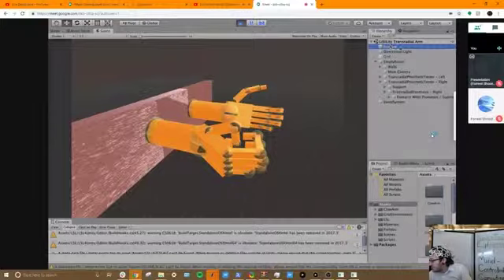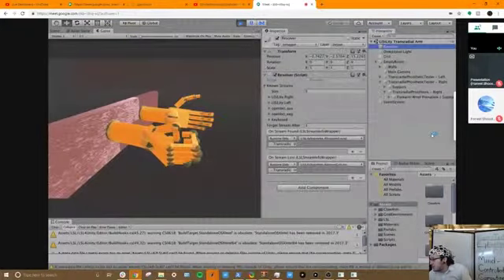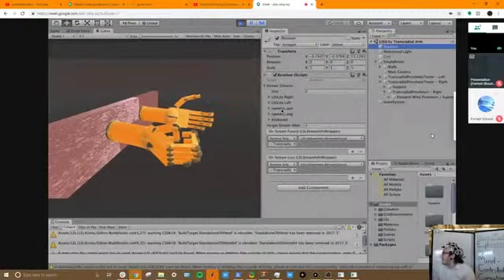So we actually have this little thing called a resolver. If I move the inspector over, you can rearrange all of the different windows that are in Unity. In the resolver, you can see all of the currently active streams, and look at that. The OpenBCI that's connected to the other computer shows up on here. So we can actually stream over the internet, as long as we're on the same network, to all the devices that are in the room, which is fantastic.